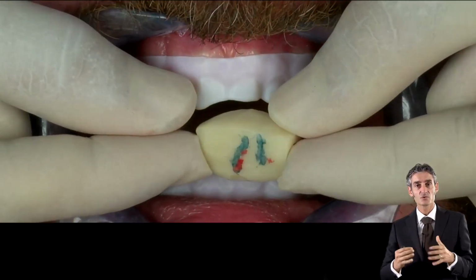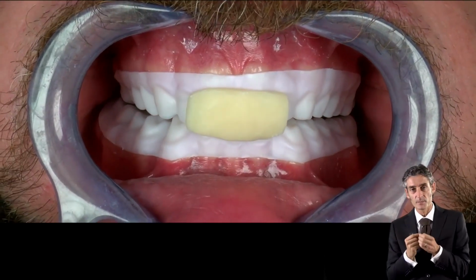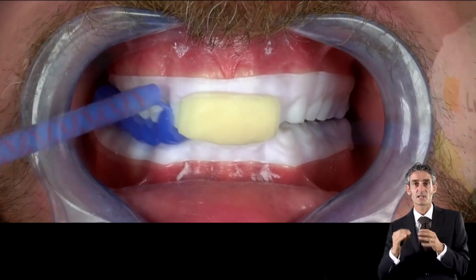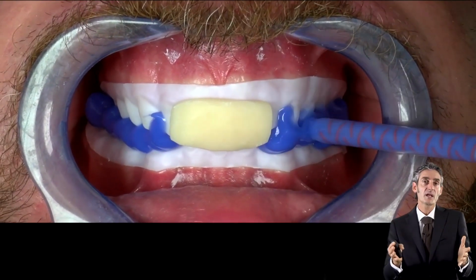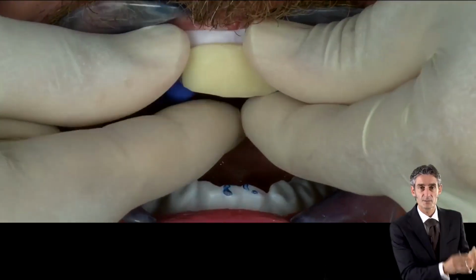Then we can ask the patient to move forward, backward, and then we can record the position through the occlusal paper. At the end, when we are sure of the position, we can inject some material between the arches, and this is the right position, or better, the CR position at the right vertical dimension. And so for us, it's the starting point.